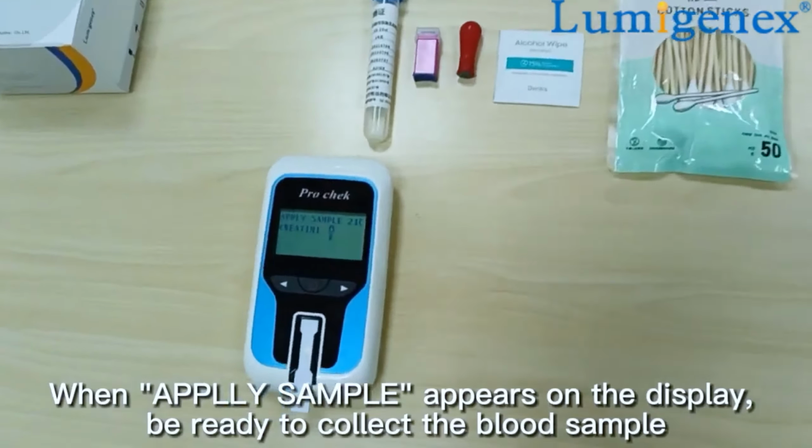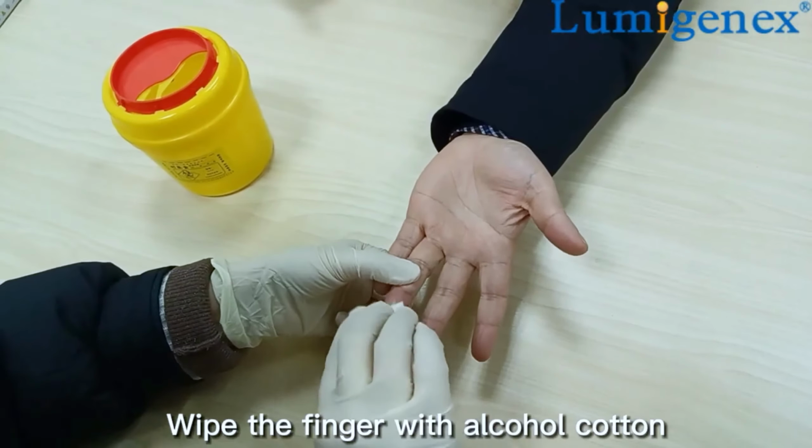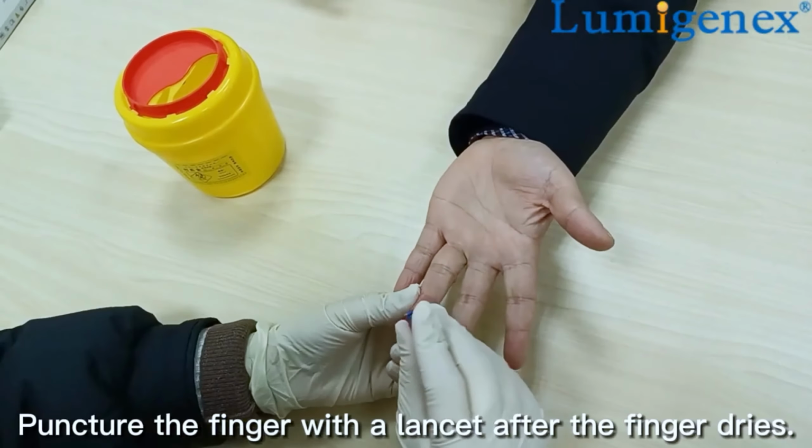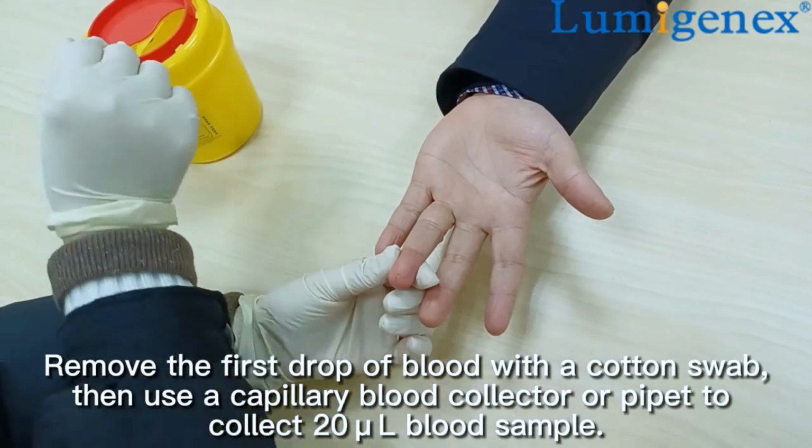When apply sample appears on the display, be ready to collect the blood sample. Wipe the finger with alcohol cotton. Puncture the finger with a lancet after the finger dries. Remove the first drop of blood with a cotton swab.